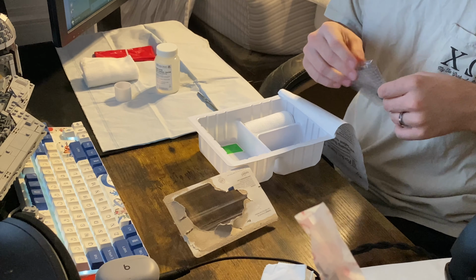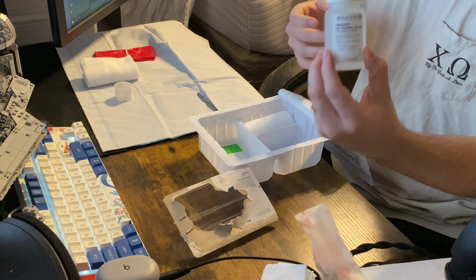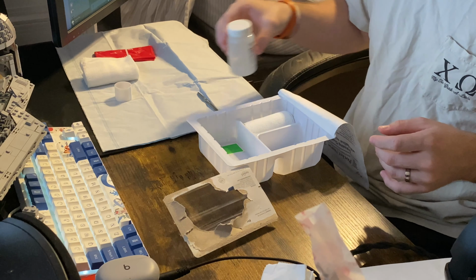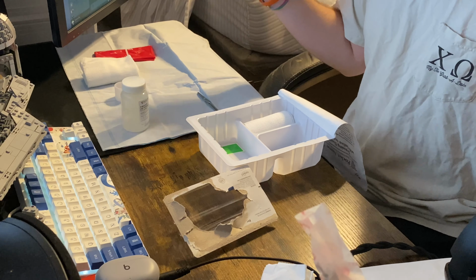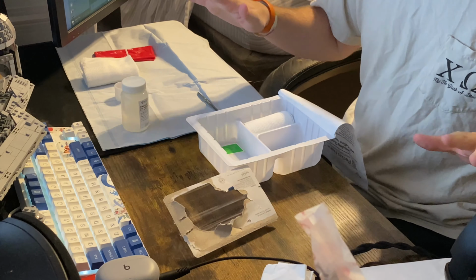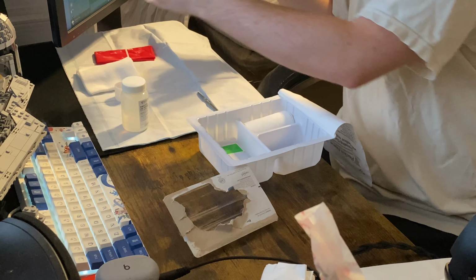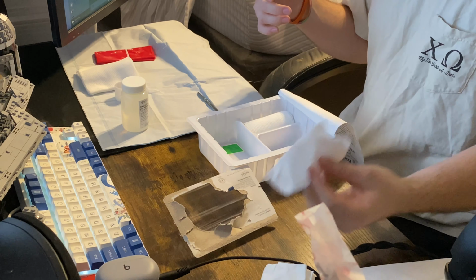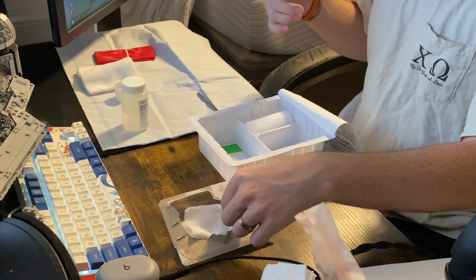So next is to dress the wound ourselves. We're going to take our normal saline solution, and the recommendation is to pour a little bit of it into our kit here. We will take one of our sterile hands and dedicate that to dipping the gauze, dampening it, not saturating it, and packing the wound. So we would start with taking a gauze, getting it in a little bit of saline, and we want to fill all of the excess space in the wound.